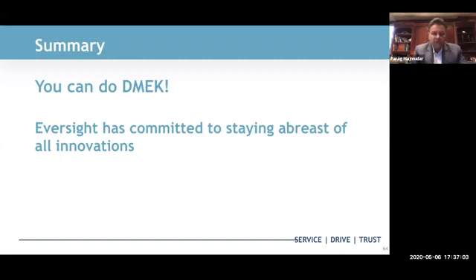It doesn't really matter. All you're trying to do is get a little bit of the SF6 or the air, whatever you're going to use, in through the paracentesis. And the paracentesis will be there for a while. Obviously, you can reopen it. Sometimes ergonomically, I found that if I'm rebubbling at the slit lamp, let's say it's the left eye, and my paracentesis is at about 2 o'clock and 4 or 5 o'clock, but my graft is now detached temporally.